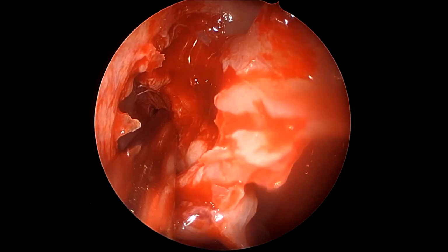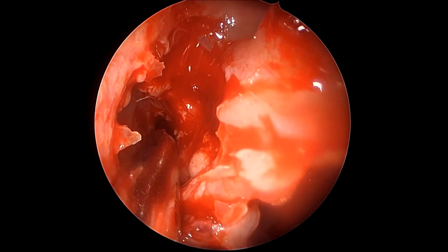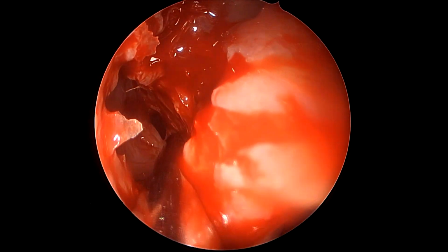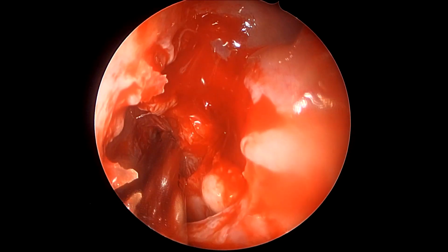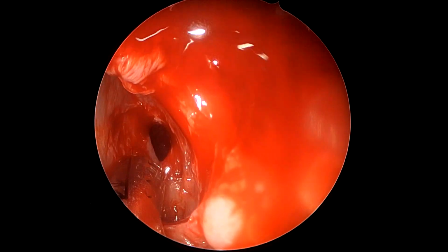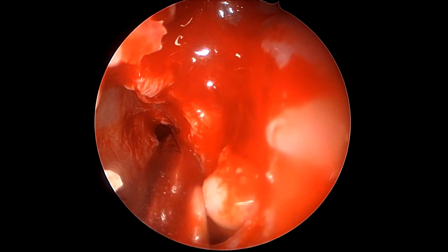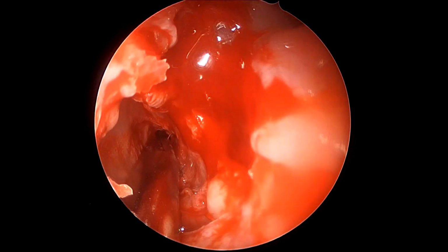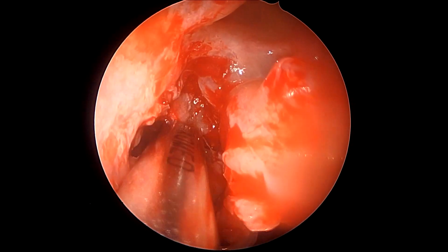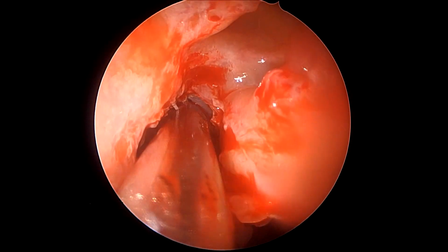As we see here, the sphenoid ostium is now open, and just like the right side, it needs to be widened slightly using a Hajek-Kofler punch inferiorly and laterally. And post that, once we identify the sphenoid conclusively and see the roof of the sphenoid, which is the lowest point of the skull base, we can again proceed to dissect anteriorly, progressively, and superiorly, following the posterior ethmoids.